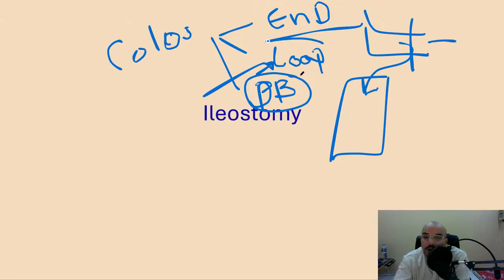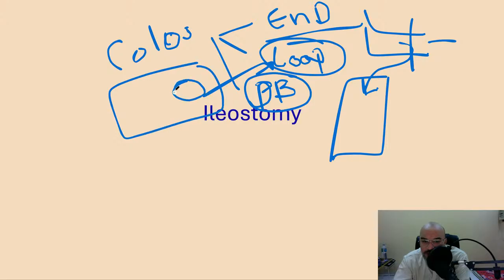With the loop itself, within the stoma we see two openings, and these two openings are connected to each other by the bridge. Under this bridge, there is something, usually a plastic piece, to protect the skin and make sure there will not be retraction, or the stoma sinking down, or any skin or epidermis covering this area and ending up closing the whole stoma.